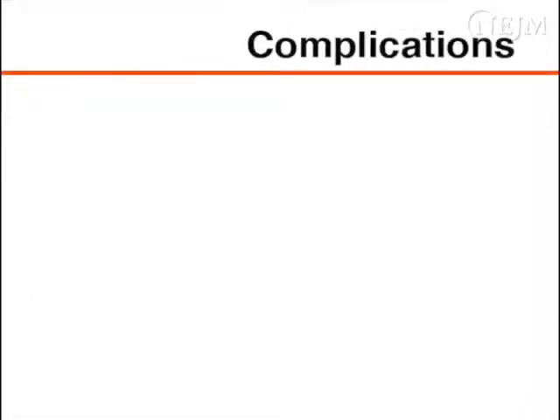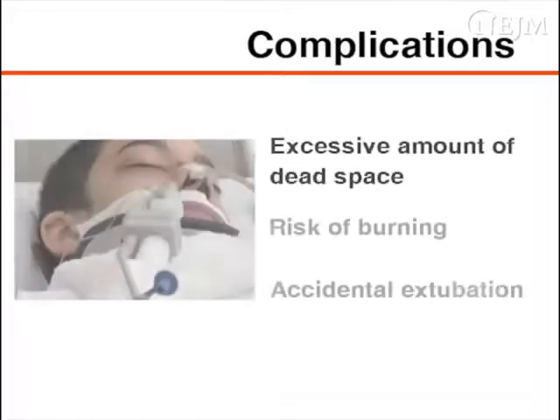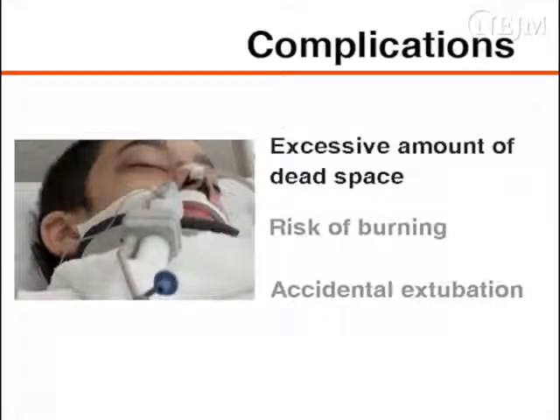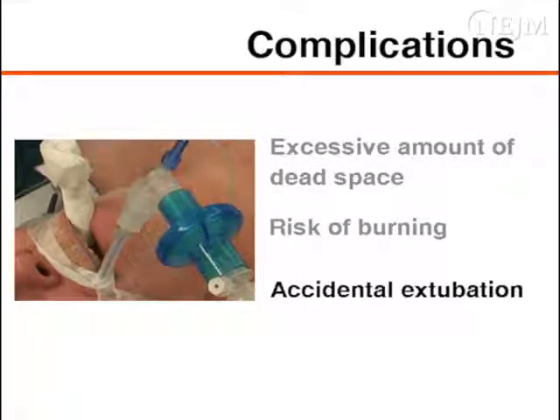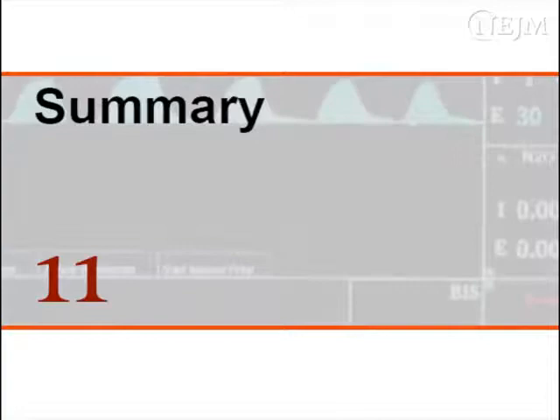Although capnography is generally safe, its use still carries a small risk of adverse events. Mainstream analyzers may introduce an excessive amount of dead space into the ventilator circuit. Older generation mainstream sensors use heat to inhibit the condensation of water vapor and prevent falsely high carbon dioxide readings. But this increases the risk of burning the patient's skin. Also, to reduce the risk of accidental extubation, caution must be taken to minimize the amount of additional weight placed on the airway. Summary.